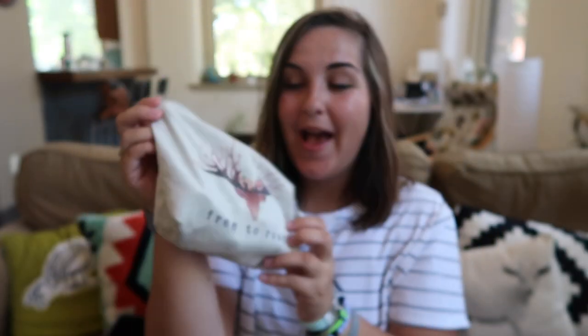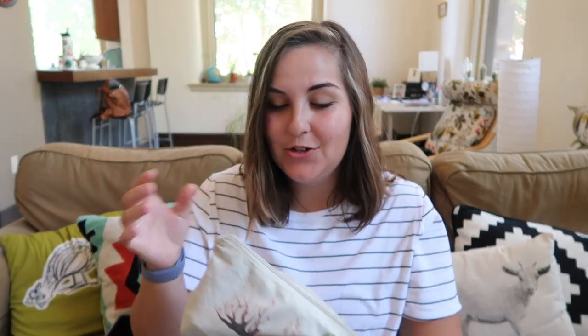I carry all my diabetes stuff in this little bag by The Tote Project. It says 'free to roam' on it. I have a cute little pin on it. Me and my friend are making pins, so I'm going to be adding some pins in the future. I'm always looking for diabetes pins to decorate my bag, just because it's fun.